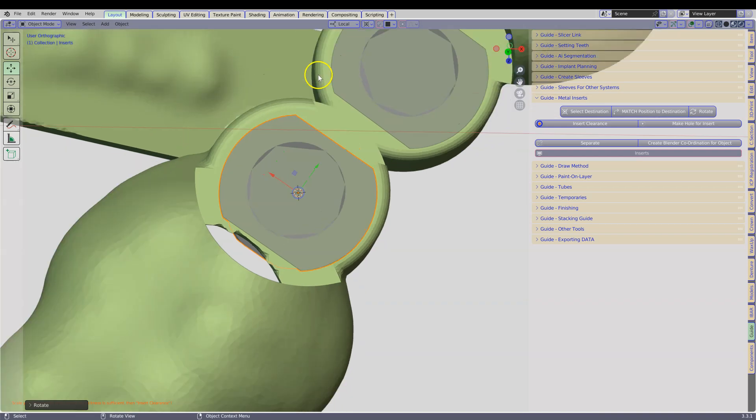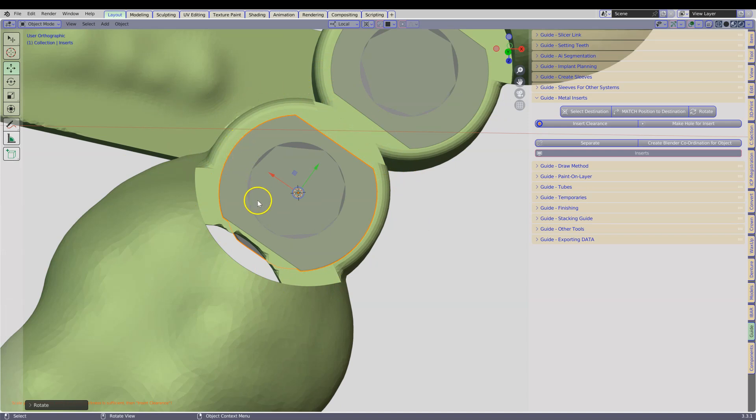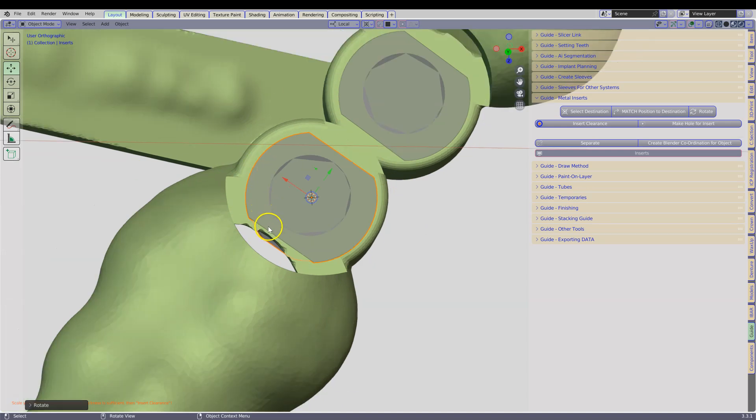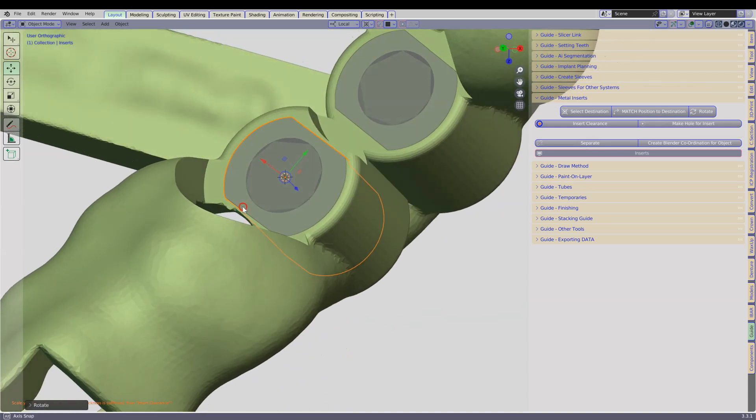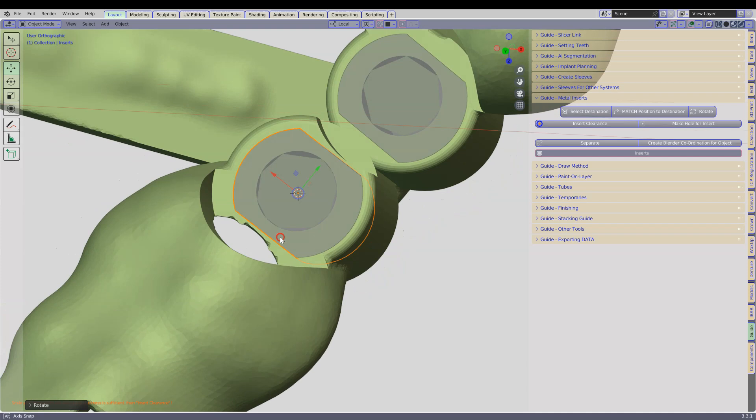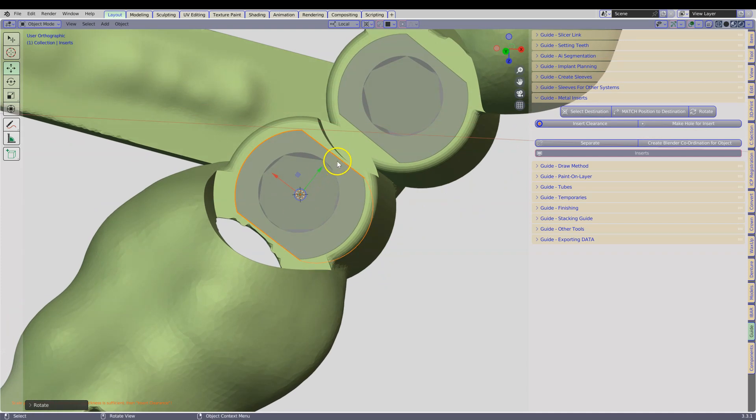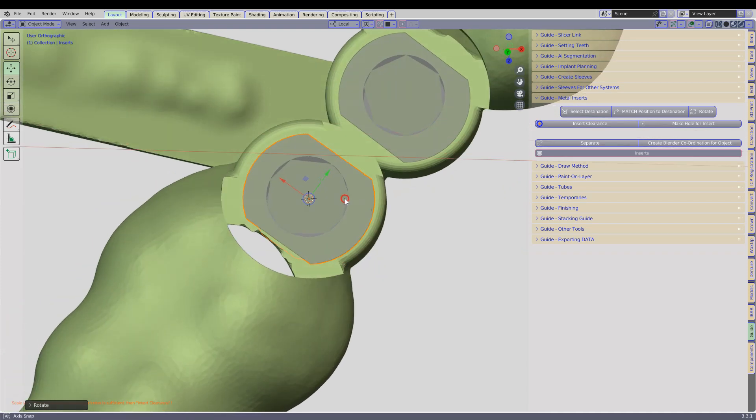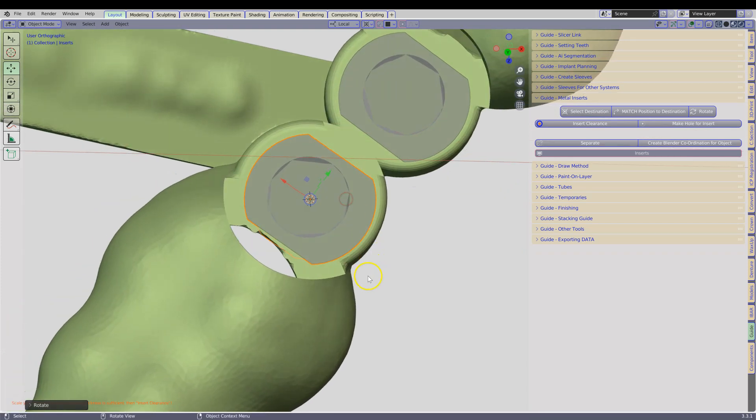So if you do decide to use Exoplan or whatever, make sure these are a little bit bigger, because the inserts are always a little bit bigger. So here we are not going to have much space, and also here we are not going to have much space.